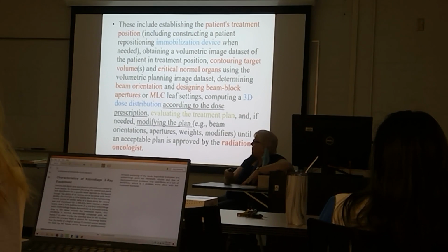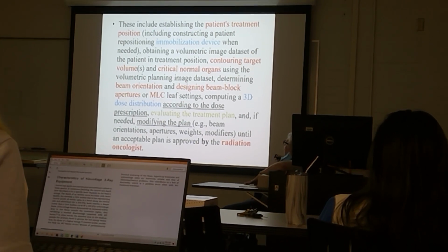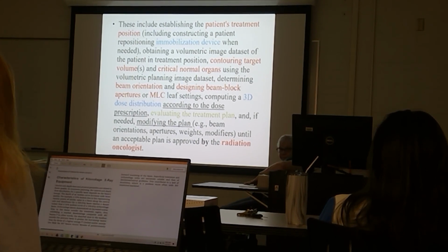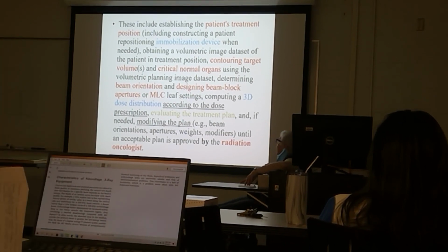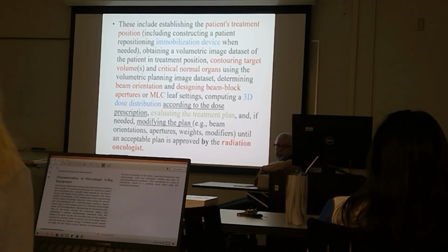And that's how it works. And according to the dose, these leaf settings have to match what the doctor is thinking. He may do something weird. He may want some part of the treatment shielded where it might not need to be shielded, but he wants to do it anyway.